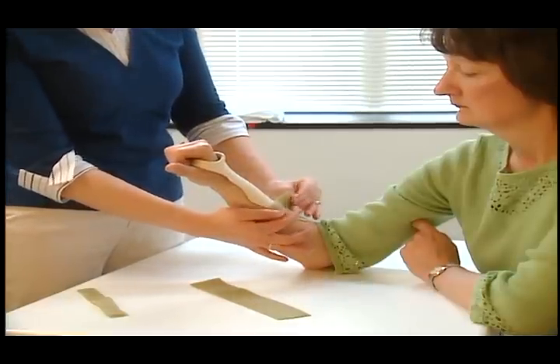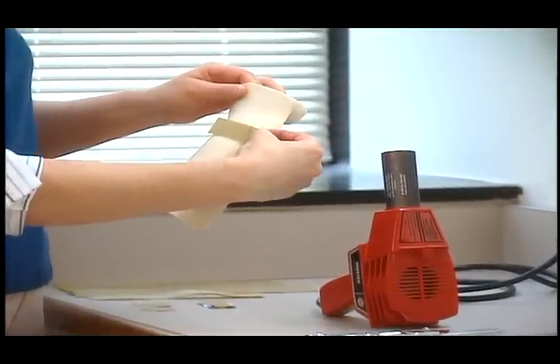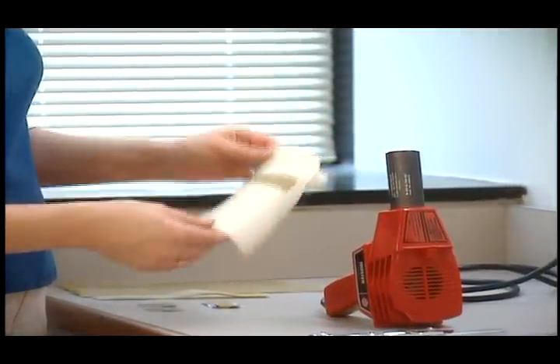Adhesive hook Velcro is applied directly to the splint. It adheres most effectively when the splint material and the sticky side of the Velcro are spot heated with a heat gun.